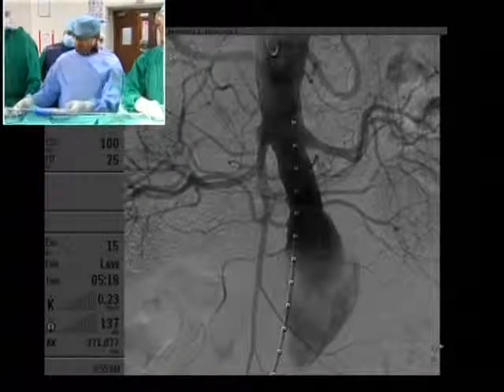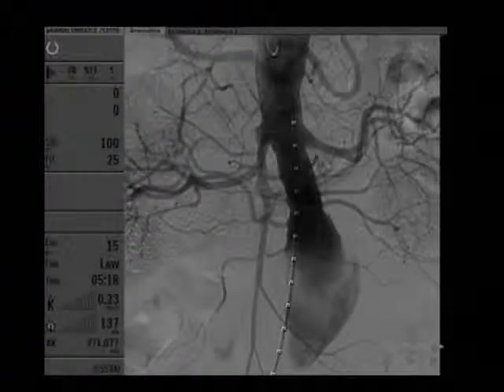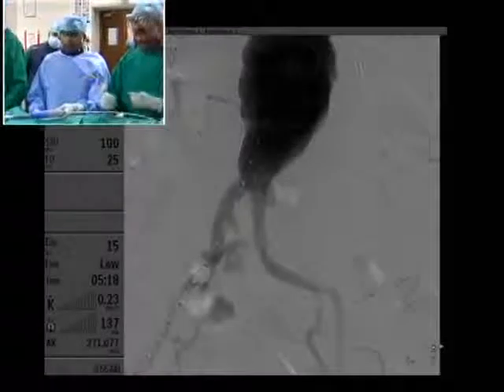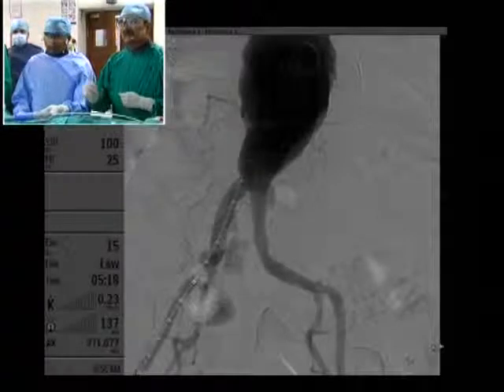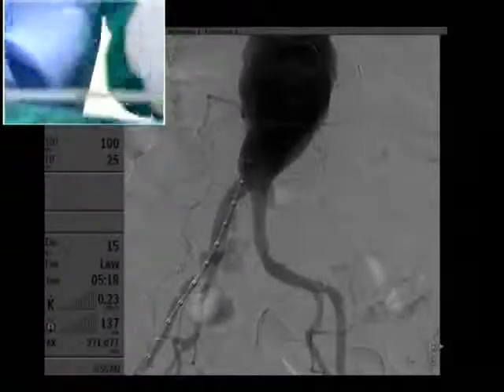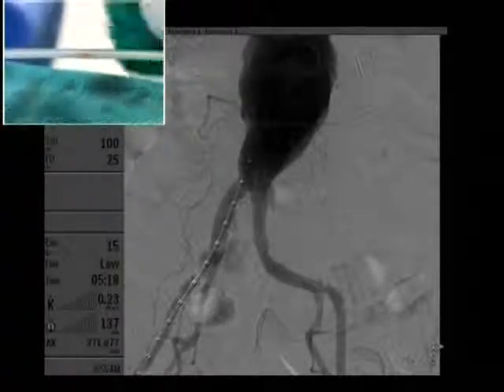To ensure that we are at the right place, what I have done is to park a catheter from the left groin in the left renal artery. The next angio, please. And this is the lower end, which we have seen as a still image earlier. There's quite a good common iliac length, especially on the left side. So the length of device we have is 145 on the right side. I think that would be enough for the right.